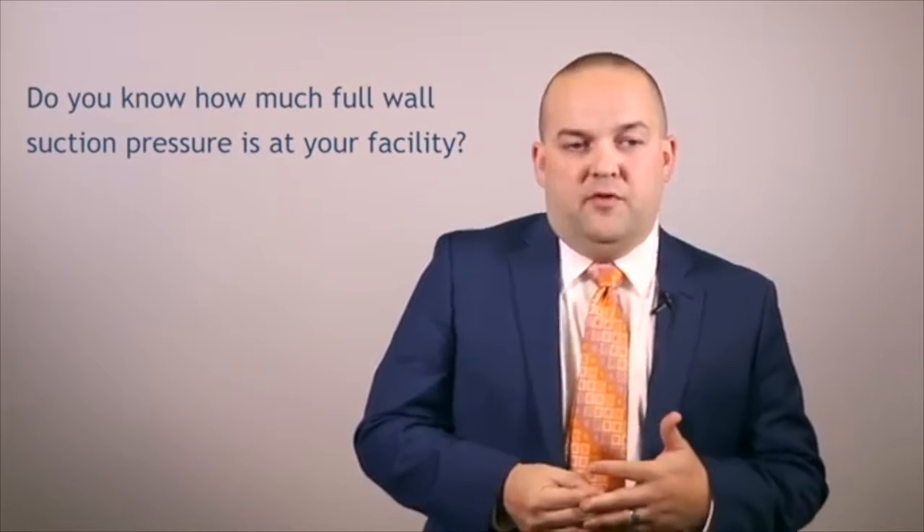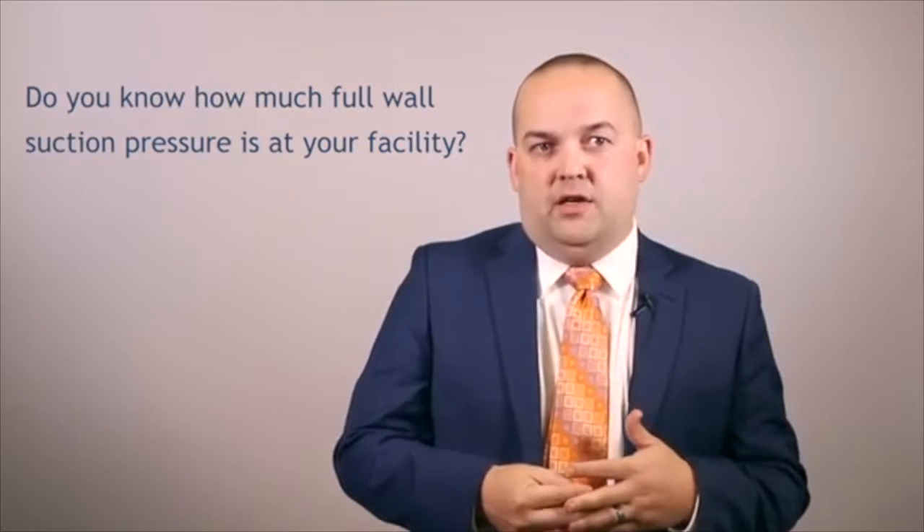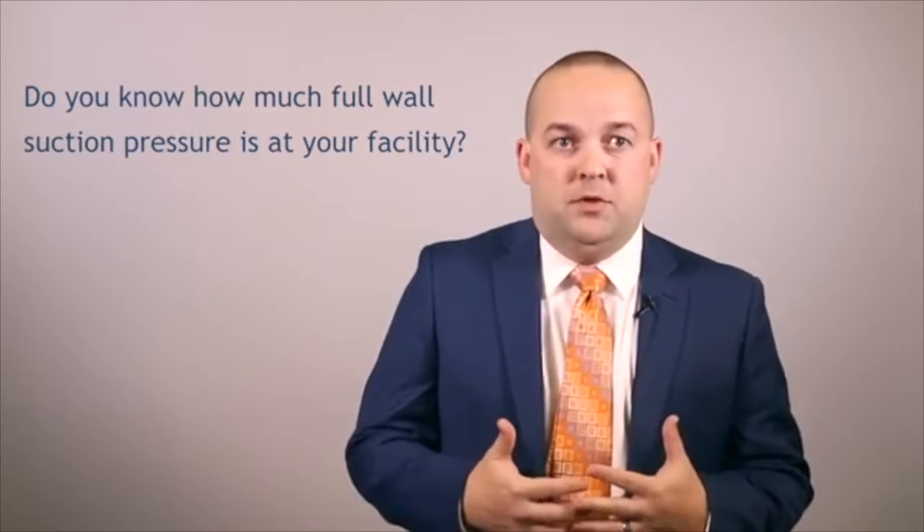From various studies we've looked at and talking to some of our local hospitals, suction can be set as high as negative 635 millimeters of mercury of pressure. That is a significant amount of pressure, and there's no wonder why suctioning with that much pressure can cause a lot of trauma and bleeding in the tracheal tissue.